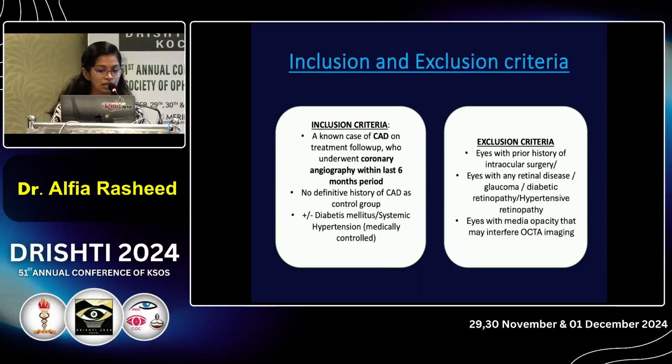Diabetes and hypertension were included, if medically controlled. And we excluded patients with a prior history of intraocular surgery, retinal diseases, glaucoma, diabetic retinopathy and hypertensive retinopathy, and media opacities that may hinder the OCTA imaging.